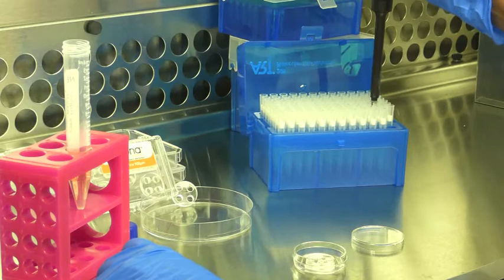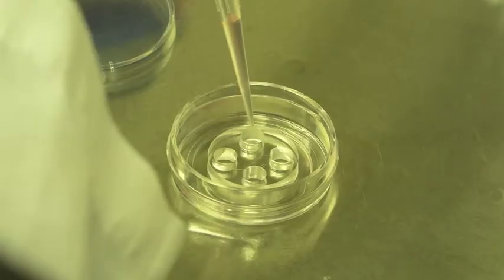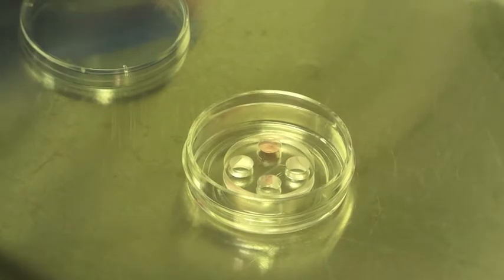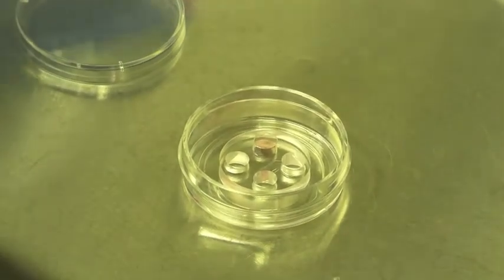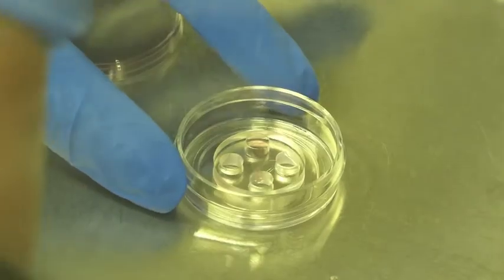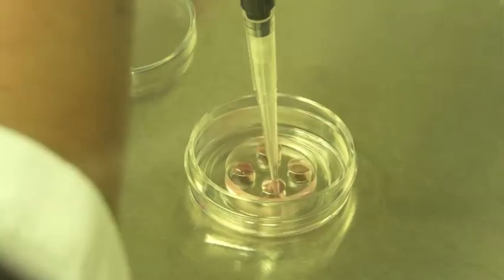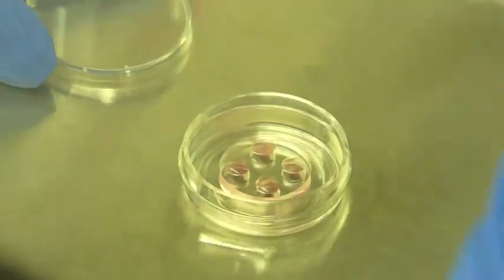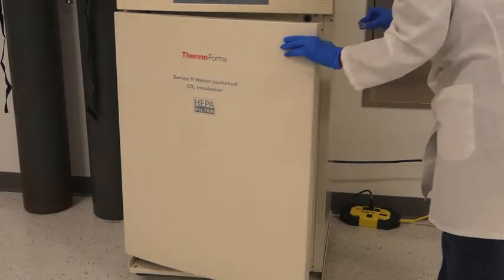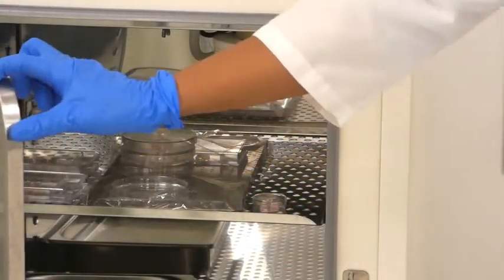Immediately add 100 microliters of neuronal culture media to each of the wells in the device in a stepwise manner. Add 100 microliters of neuronal culture media to the top left well. Allow the media to enter the main channel for 30 seconds to 1 minute. Then fill the bottom left well with 100 microliters of media. Wait for 5 minutes, then follow the same process with the right top and bottom well. Cover the dish and place it into a 5% CO2, 37°C incubator until ready to plate the cells.